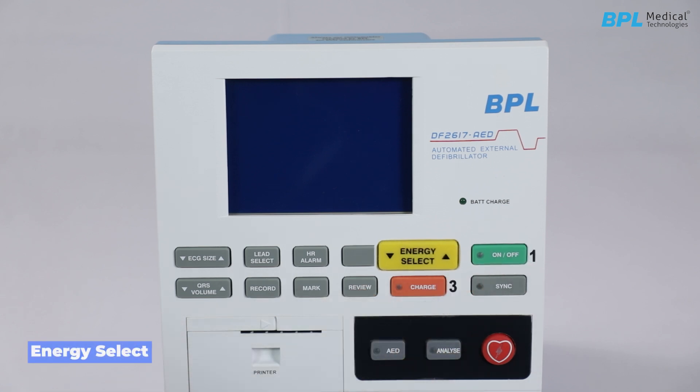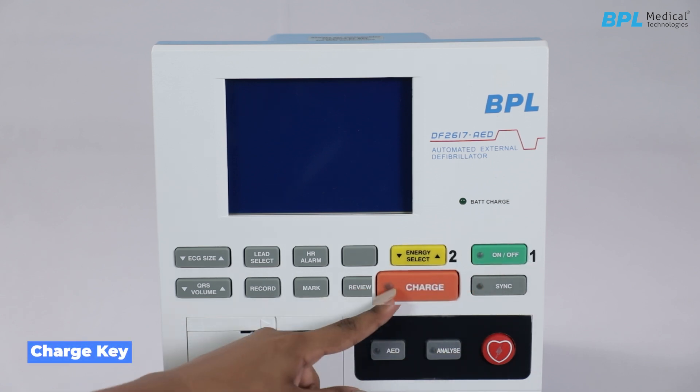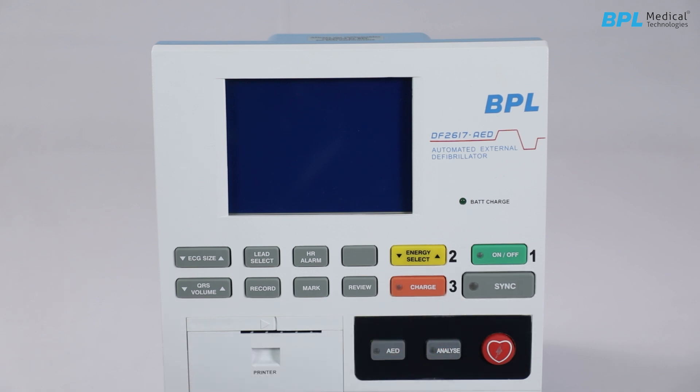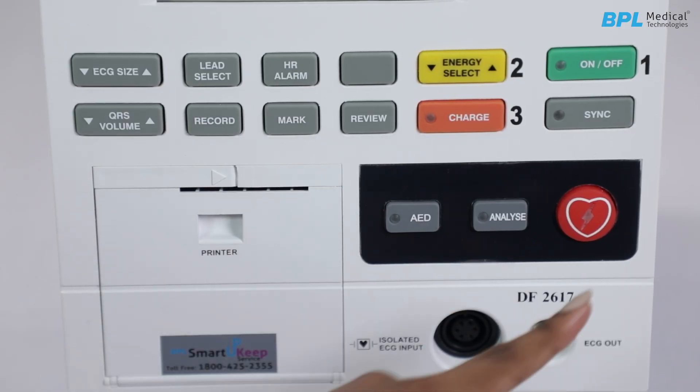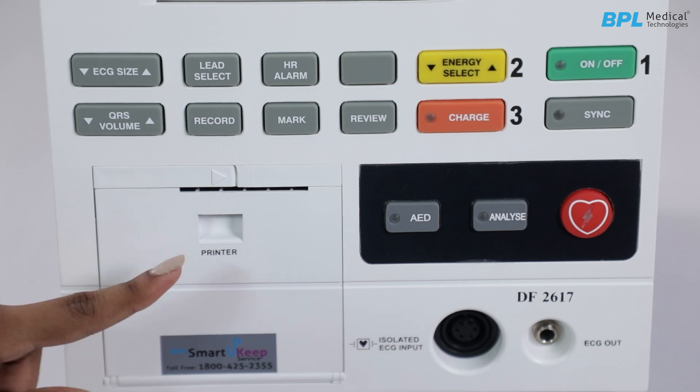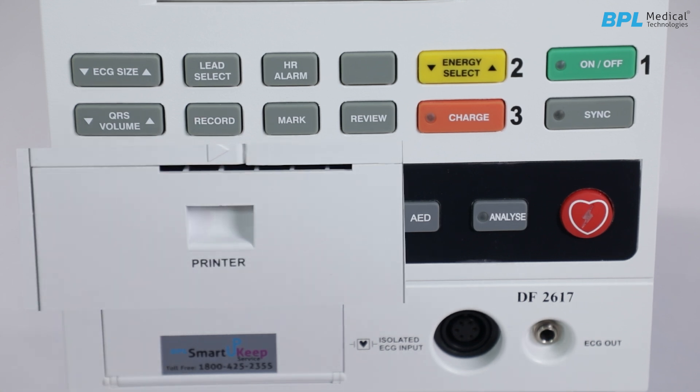The front panel controls include: ON/OFF key, energy select, charge key, sync key, HR alarm, lead select, ECG size, QRS volume, record, mark, review, AED key, analyze key, and shock key. There is also a printer on the left-hand side.